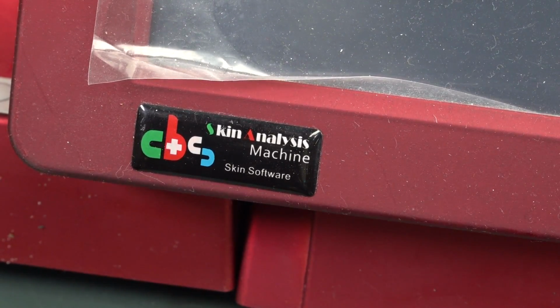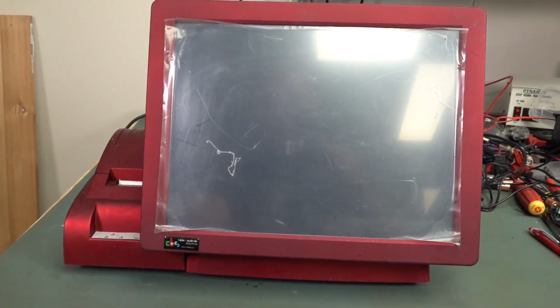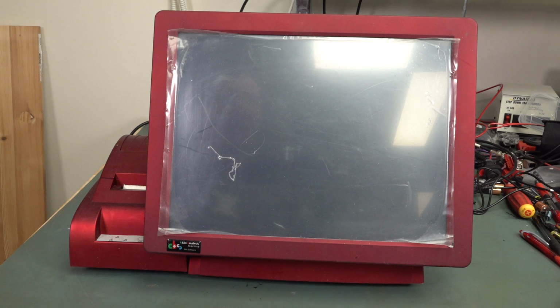It's a skin analysis, CB something, skin analysis machine running skin software. So this is obviously not really medical, it's more a beautician thing, I think, in terms of analyzing your skin or something like that. Although it could be a skin cancer check thing maybe.